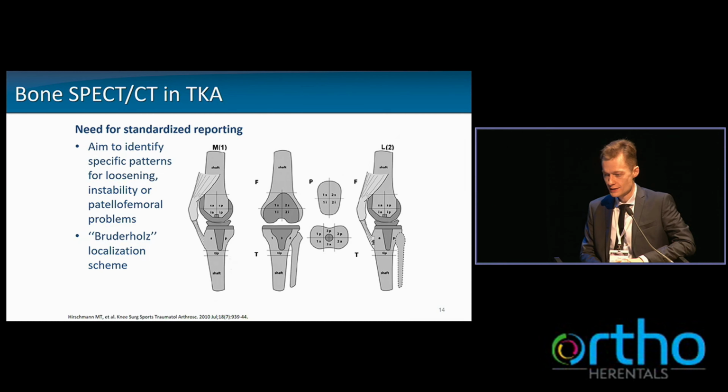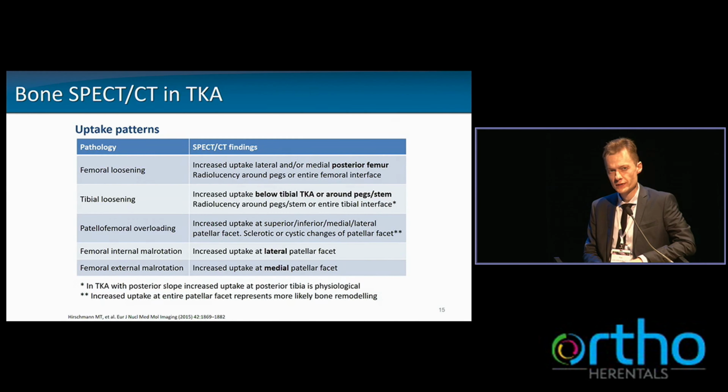But that, of course, requires training and experience and standardization. So we are probably not using this as much as we should, but the data is out there, it has been published, that if you use standardized ways of reporting bone scintigraphy of these uptake places, as you illustrated on this slide, you can actually come to a table of uptake patterns that you can combine and explain by what is a physiological or a pathological pattern of uptake given that specific biomechanical situation of that knee arthroplasty.